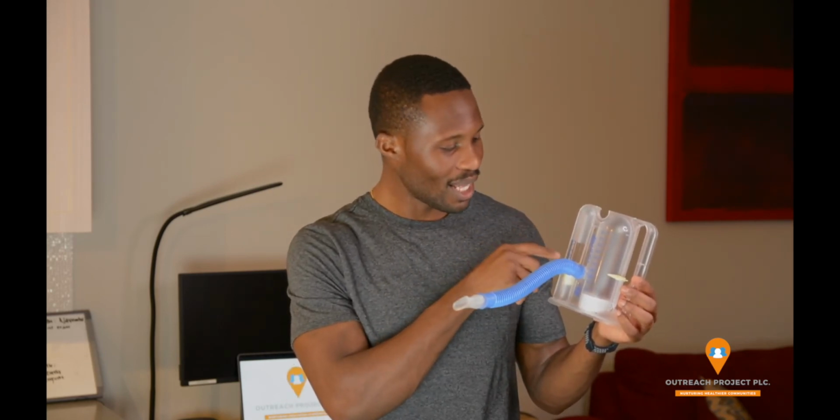The next part that I look at is this part right here. Depending on how they inhale, if they inhale too rapidly, this bar goes up all the way. And if they inhale and it's not enough, it's too shallow, then the bar doesn't go up enough.